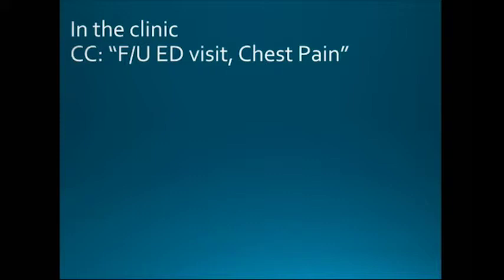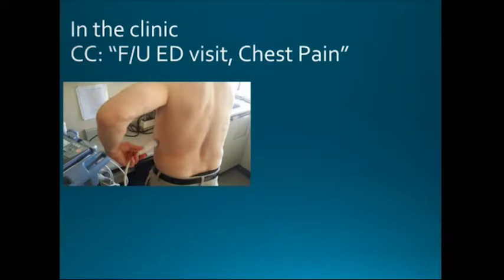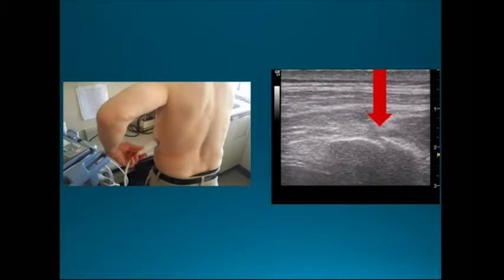And he saw me, and he was having this chest pain, and I said, is it specific to a spot? And he's like, it's kind of all over. It's several spots, but it's here, and then it kind of also radiates around over here. And I said, okay, well, what I want you to do is take this probe and put this probe where it hurts the most. And you put the probe right about here. And then right about here, this is what I saw. Oh! So remember, white is very dense, and so this is actually white with shadow. So this is bone, and this is his rib right here.